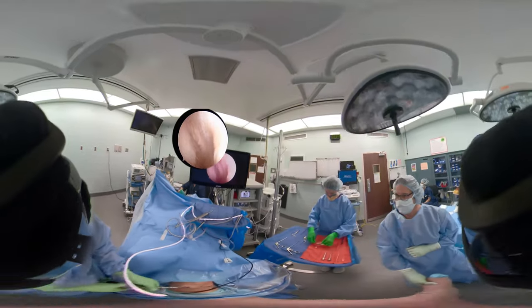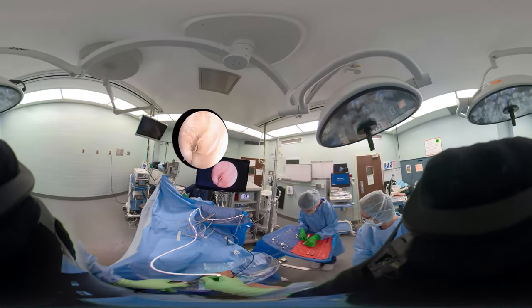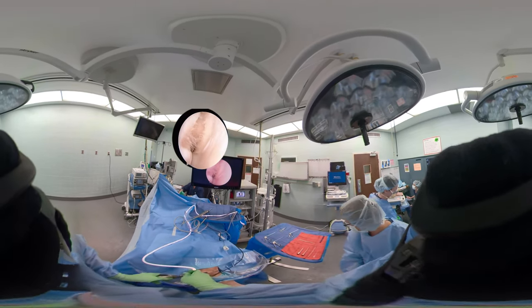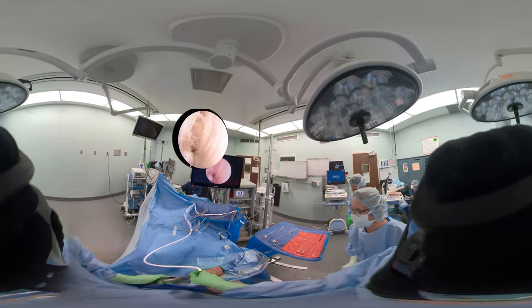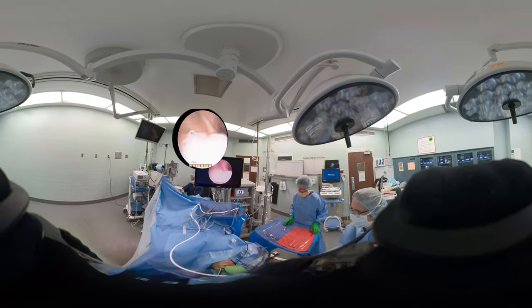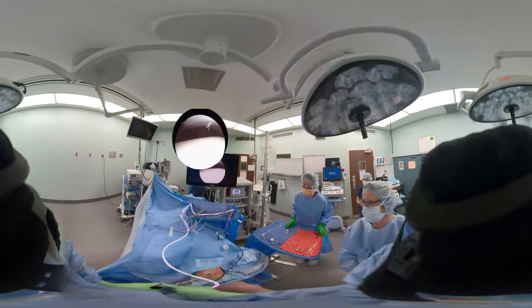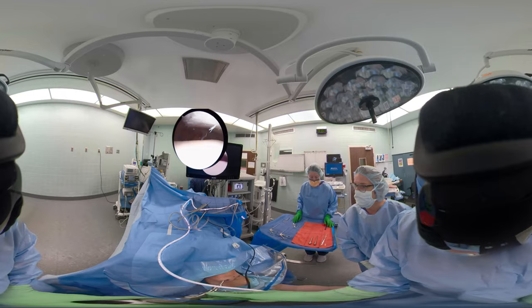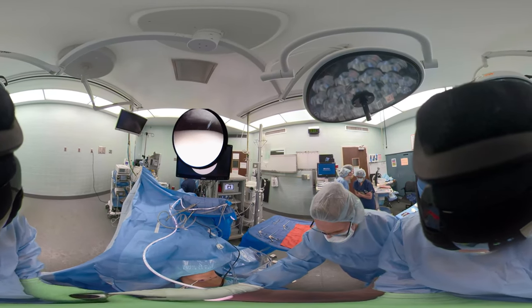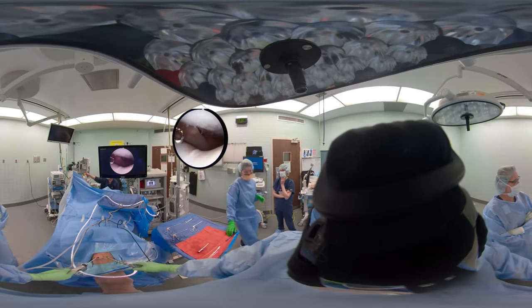The scope is now in the medial portal. When you change your scope to another portal, it is better to use a cannula obturator rather than putting the camera directly in, because you can ding the tip of the camera and have to send it off to be buffed. You can see here where we're changing the light around. Now we're looking through the medial portal again for the donor lesion — where did that loose body come from? It came from the medial patellar facet.